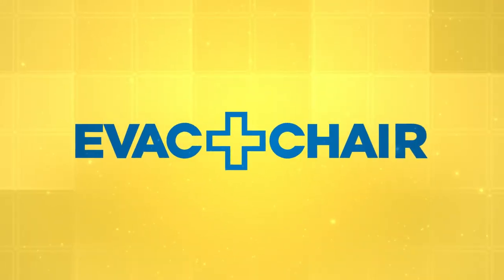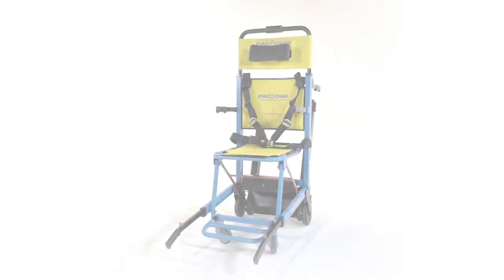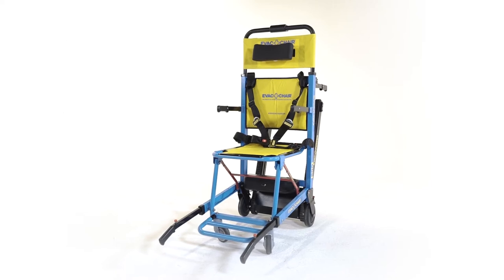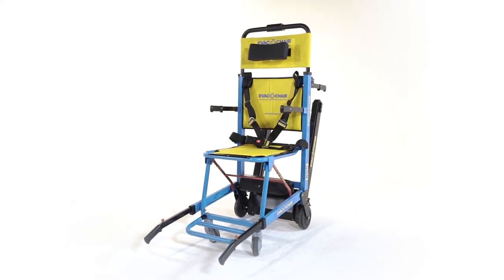Welcome to our 2-minute Evac Chair virtual demo. This video is going to show you why the Evac Chair is the world's number one stairway evacuation chair. The Evac Chair Power 800 provides a complete stair ascending and descending solution. It can be used by a single person providing quick, easy and safe stairway ascent and descent.